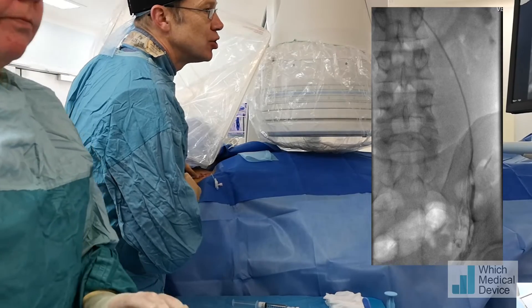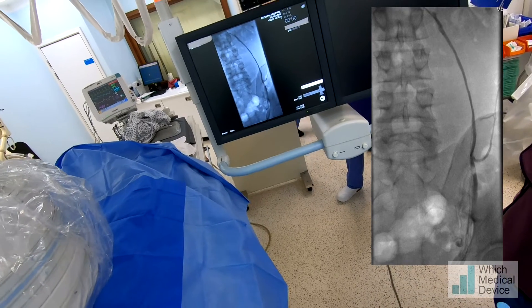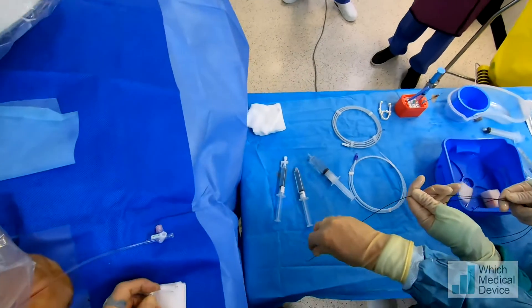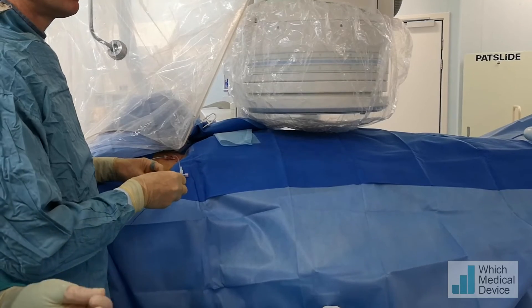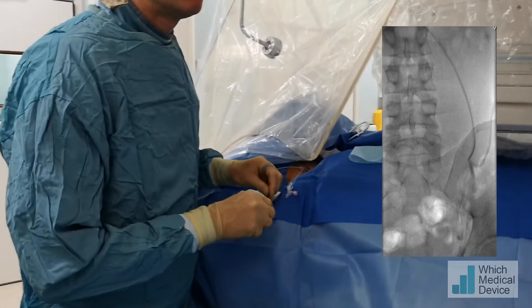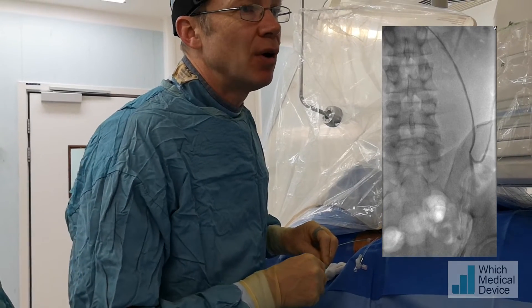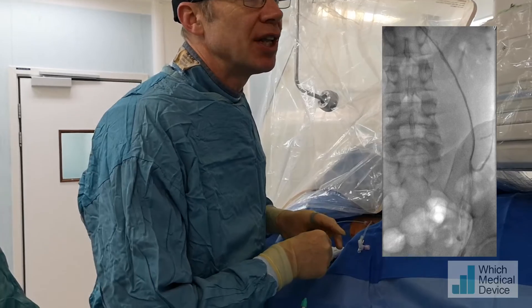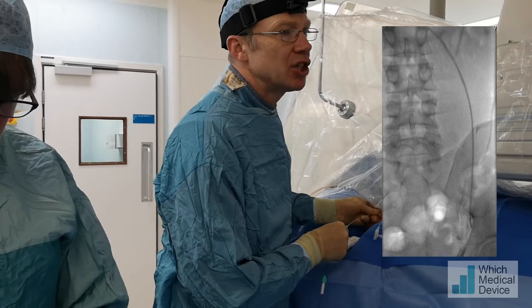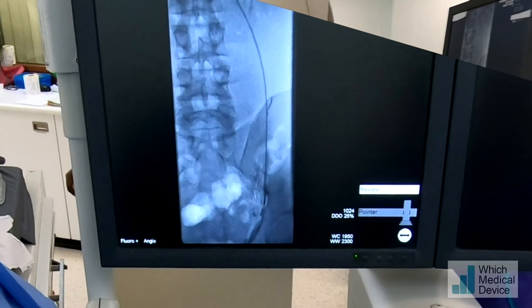You can see it just there. I'm just going to redirect and put the wire back down into that branch. These veins are fairly fragile, so you've got to be a little bit careful. It's not really a good idea to advance the catheter without the wire. We've got the wire back down now, taking the catheter a little bit further down. We're just going to check our position again with contrast — and you can see we're in the main gonadal vein now.